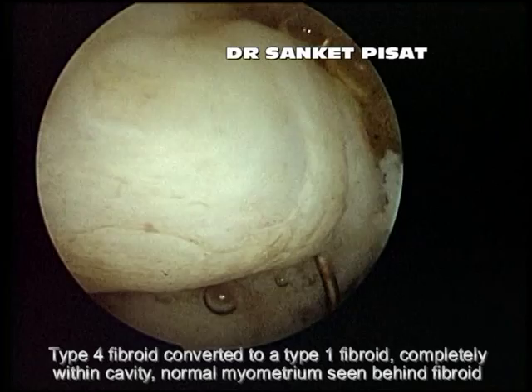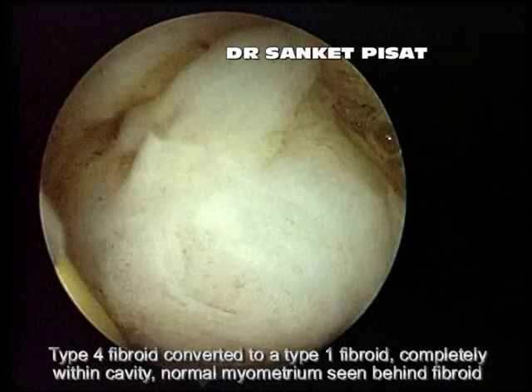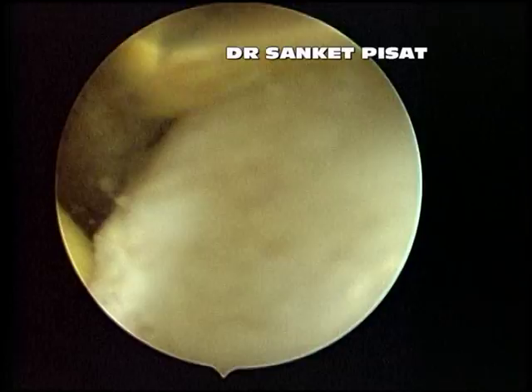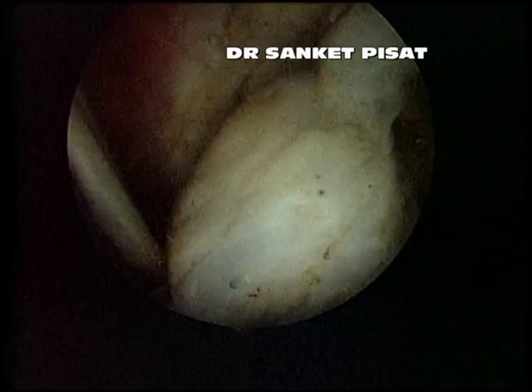Effectively, a type 4 myoma has been converted into a type 1 myoma, completely eliminating the need for burrowing into the uterine cavity and thereby decreasing the risk of perforation.